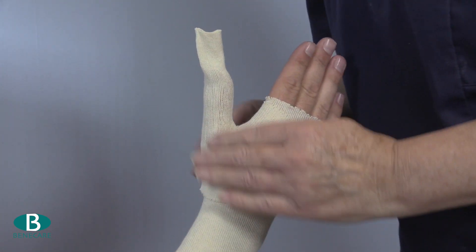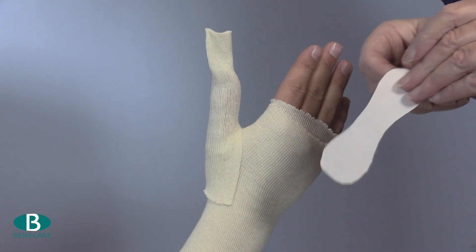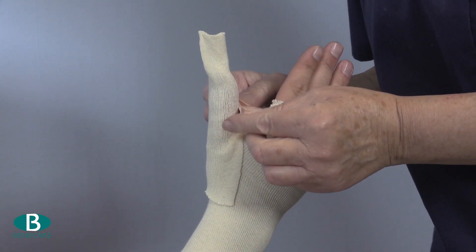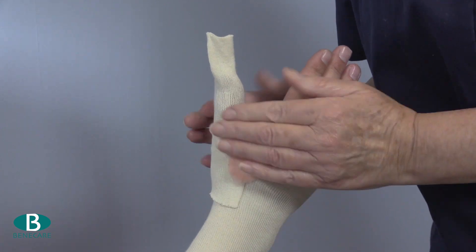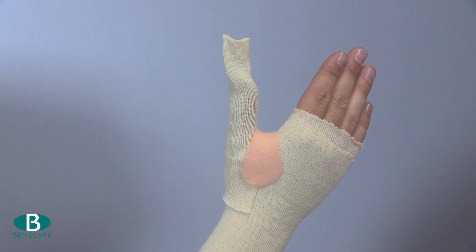Now apply fleecy web for additional protection. Cut the fleecy web so it is narrower in the centre and place this over the web space. The MCP joint and ulnar styloid are also areas to consider if the splint is extended over the wrist.